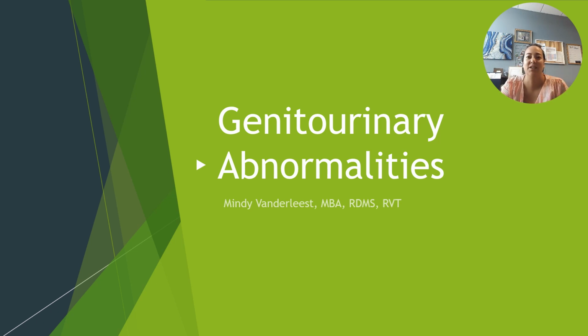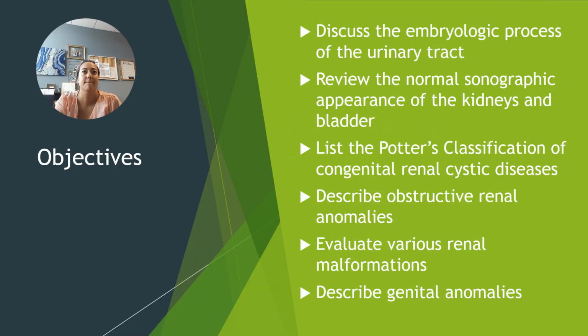Hello, today we are going to go over genitourinary abnormalities in the obstetric patient. So we're going to start out by talking about the embryologic process of the urinary tract development, and we will review normal ultrasound findings of the kidneys and bladder, as well as genitals.